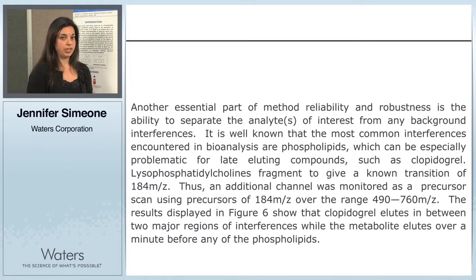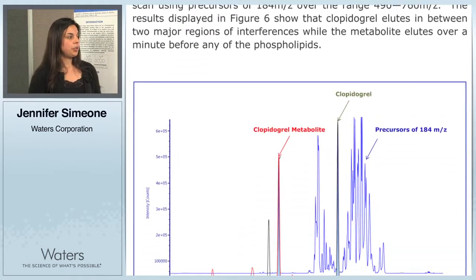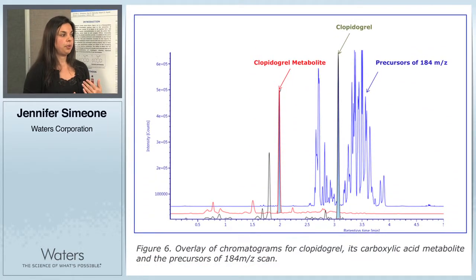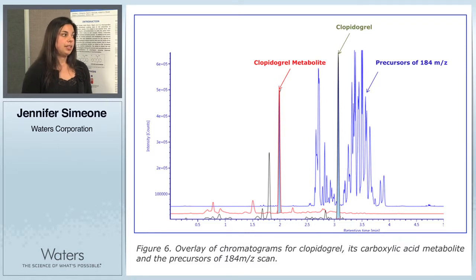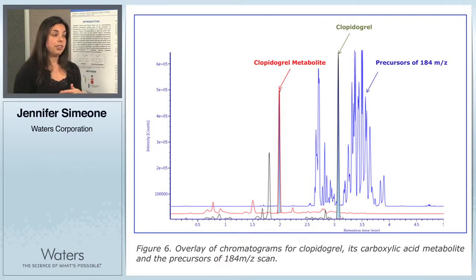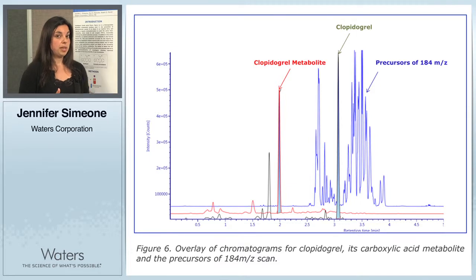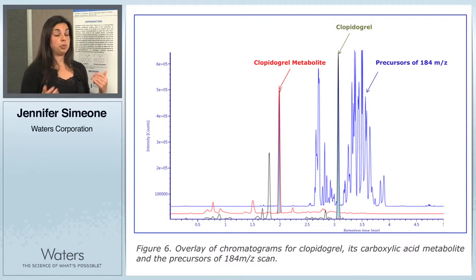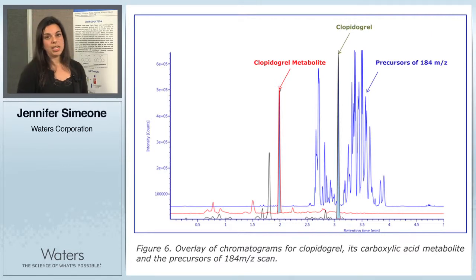An easy way to monitor for these is to do a precursor scan of the common 184 m/z fragment. In figure six, it's an overlay of the Clopidogrel and its metabolite, with the precursor scan for the 184 m/z in the background. You can see that the Clopidogrel metabolite elutes much earlier than the phospholipids. Plavix, on the other hand, is in a region susceptible to matrix interferences, but the LC method was modified so that it elutes in between two larger regions of phospholipids. In this way, we have successfully separated both analytes from the phospholipids, generating a much more reliable method.